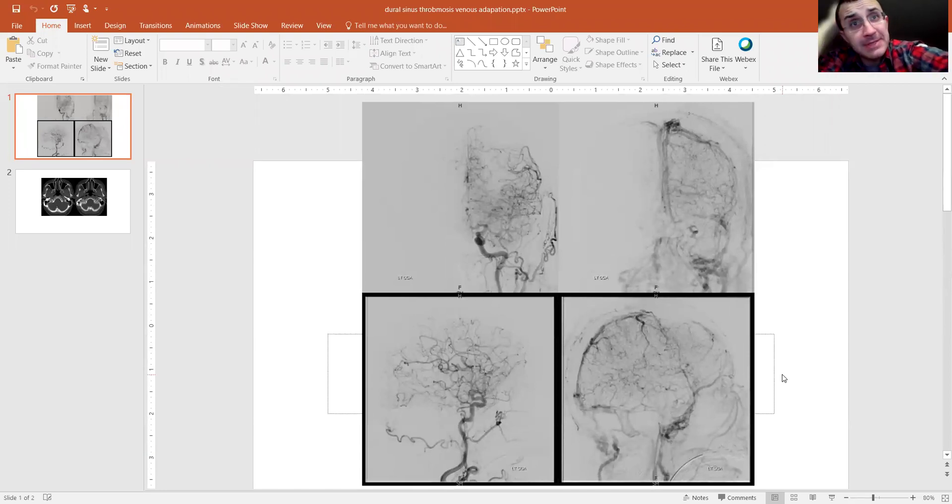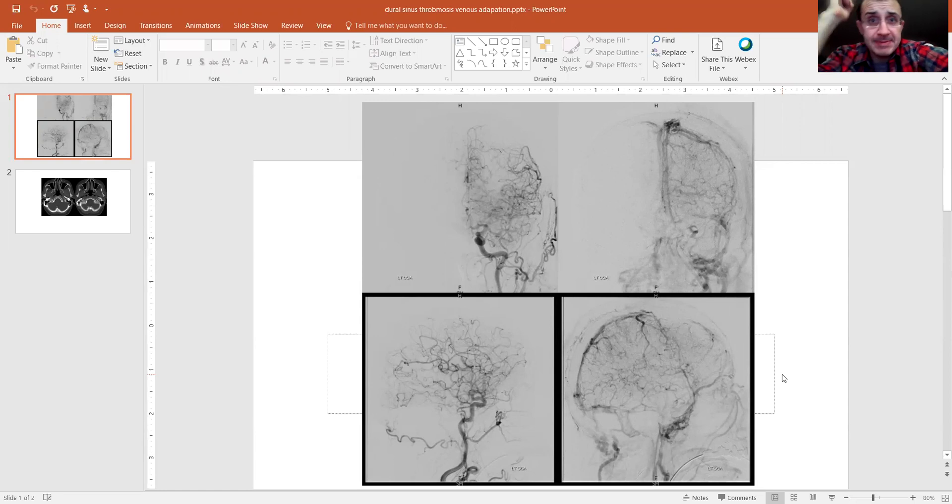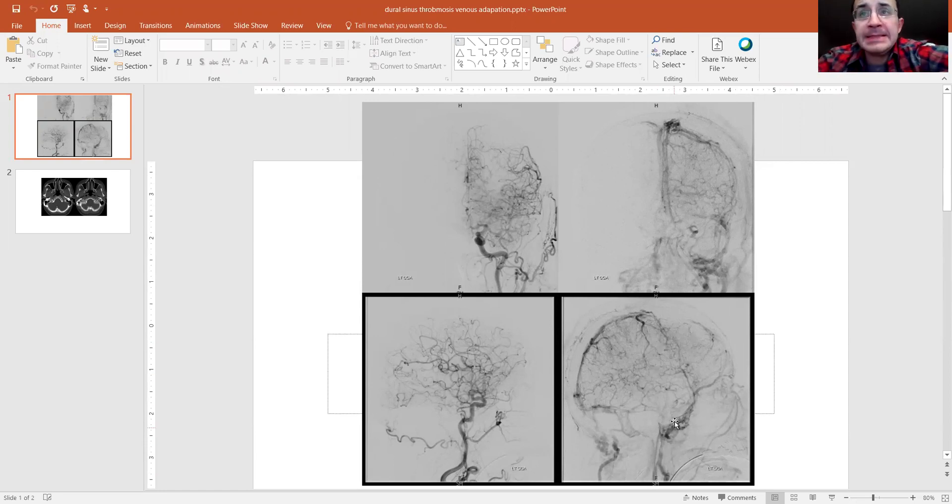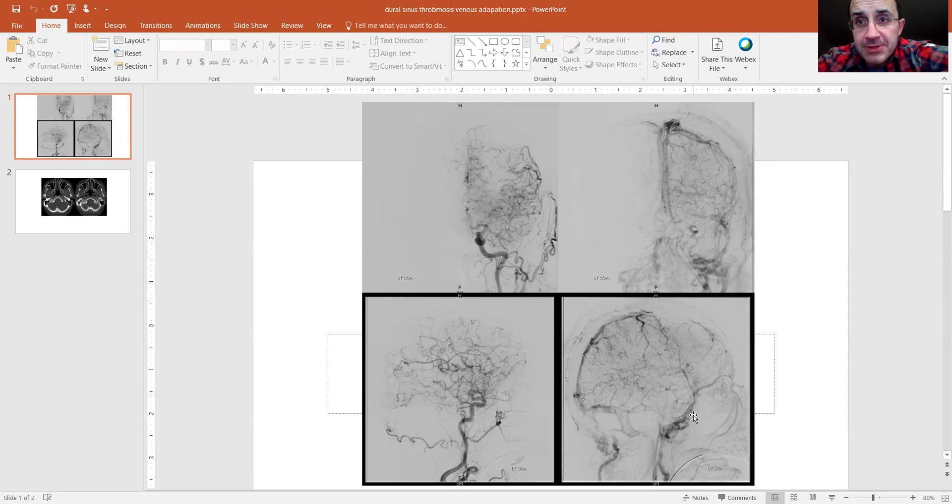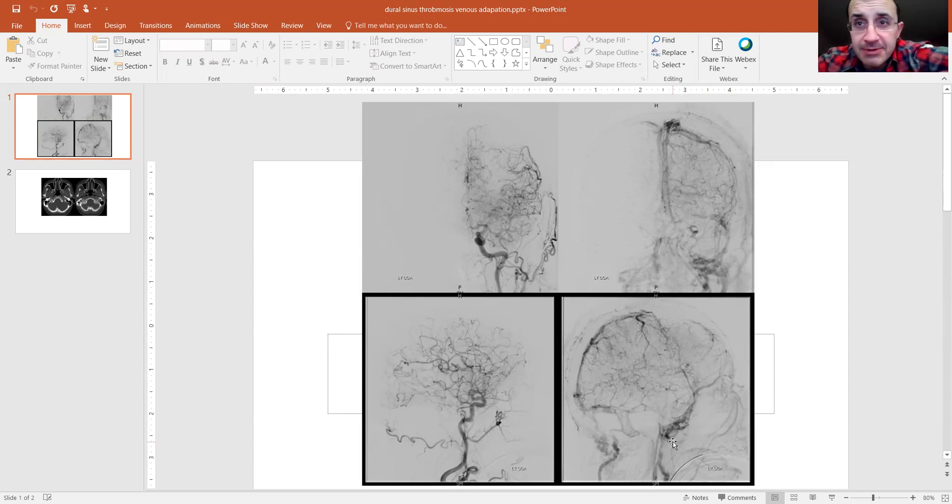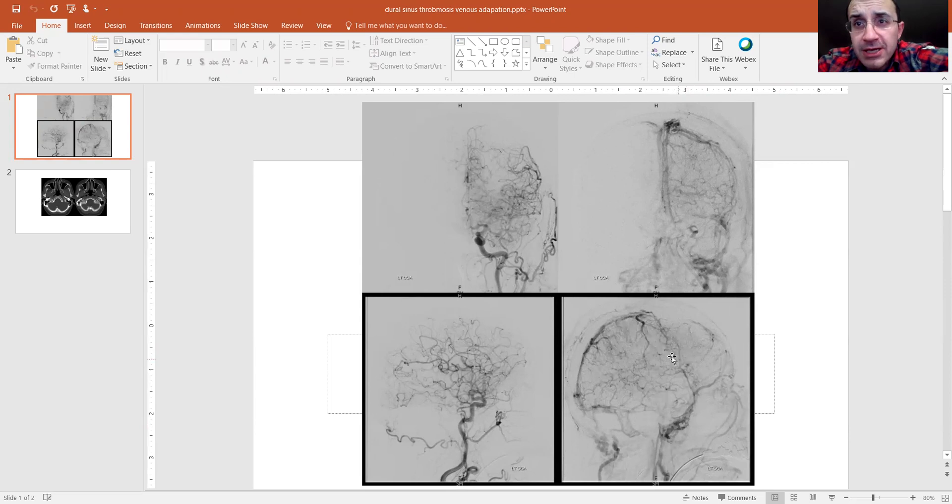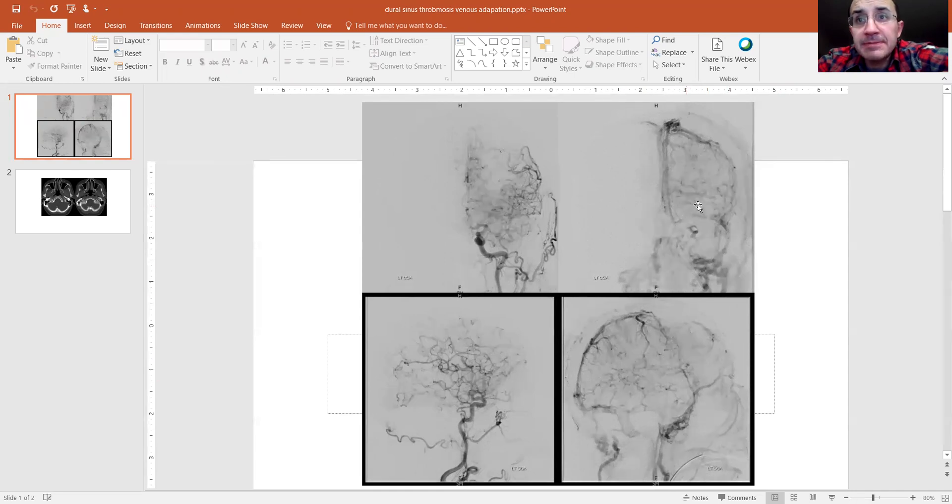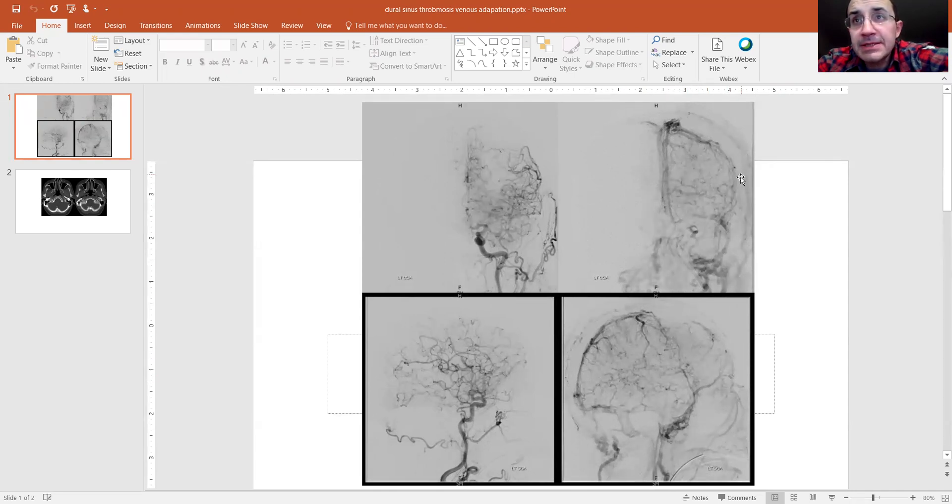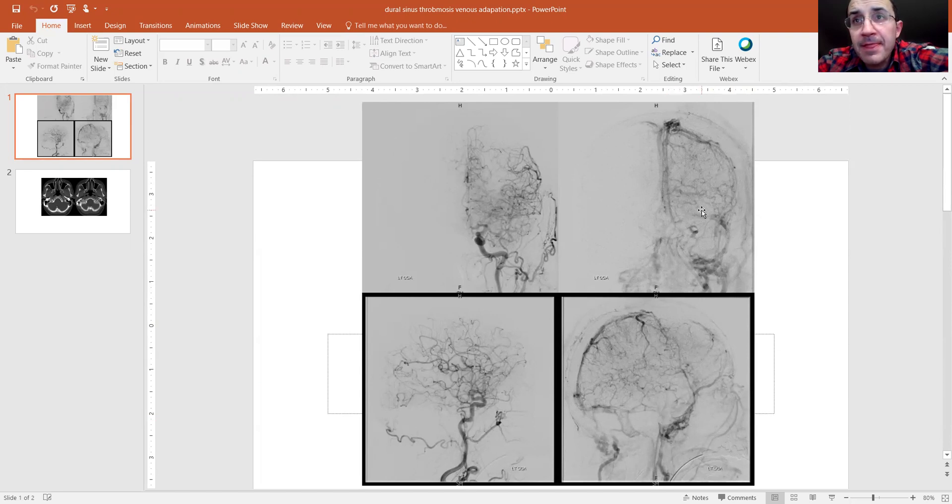So look at this. This is the left hemisphere injection. Now, what do we see? Again, put this together in this patient here. On this side, what you see is the dominance of the superficial sylvian veins. They were hypoplastic on the right. They're not so on the left. So on the left, there's dominant sylvian veins. And you see those are going to collect a lot of this territory here. And they're going to drain down into this. You can see them kind of coming up around here.